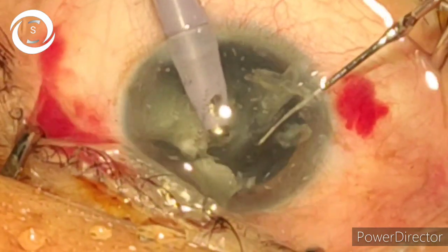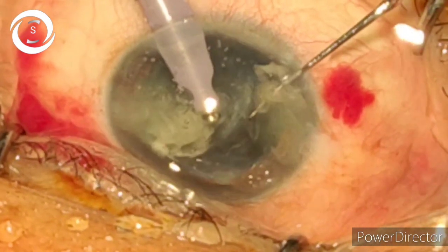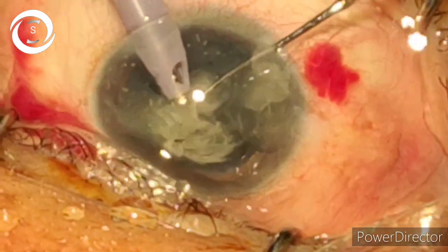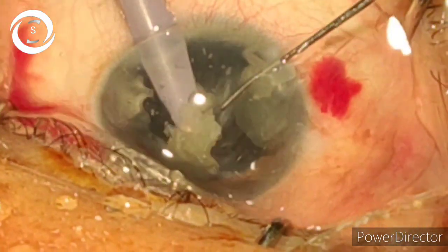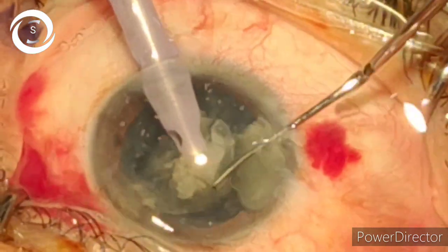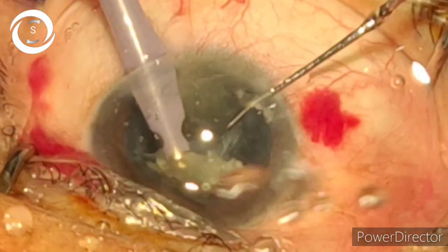So you can see how I tilt the nucleus forward, rotate it, and chop it with force from backwards to forwards. You also eliminate the risk of PCR because if you force the chopper from front to back as a routine, it may tear the posterior capsule.